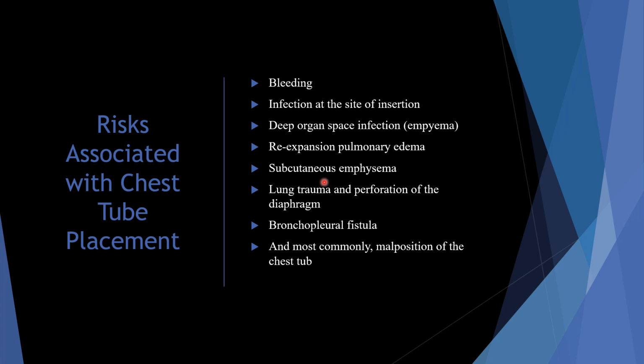You can get subcutaneous emphysema. And we talked a little bit about that in class, where you get all that crackling and the crepitus. You can have lung trauma where you have a perforation of the diaphragm. You can actually get in there and cause damage to either the spleen and or the liver. You can have bronchopleural fistulas that develop from that. And most commonly, you can have a malpositioning of the chest tube itself.